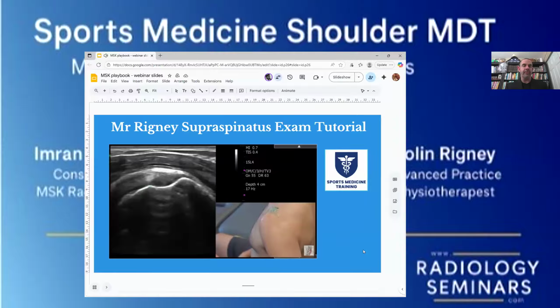The footprint is from here to here. So I'm about right. It's 1.14 centimeters, 11 and a half millimeters. So we ballpark that just about right. And then from here down is your articular margin.